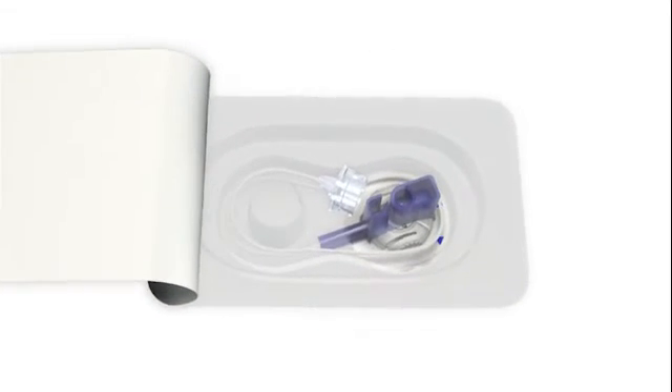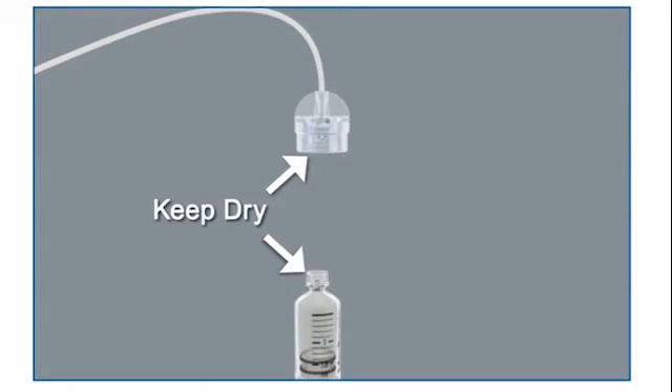Remove the infusion set from the package and connect it to the newly filled reservoir. Make sure both the top of the reservoir and the connector are dry before connecting them. Liquid can temporarily block the vents on the tubing connector, which may result in the delivery of too little or too much insulin, and can cause hypoglycemia or hyperglycemia.